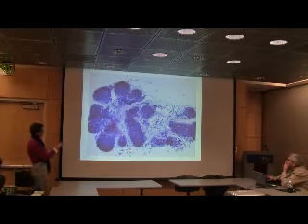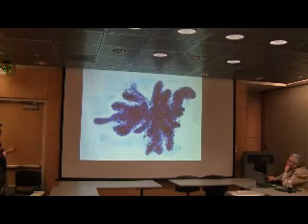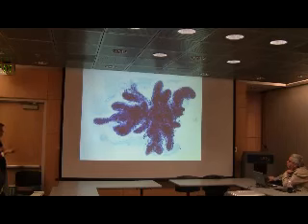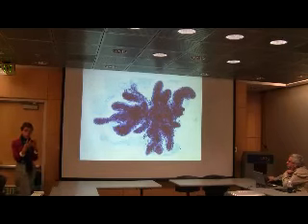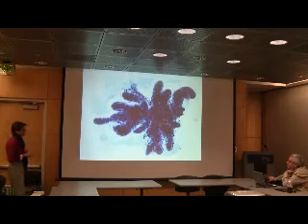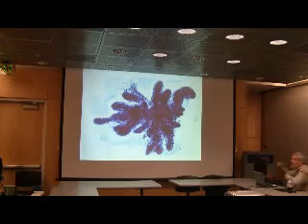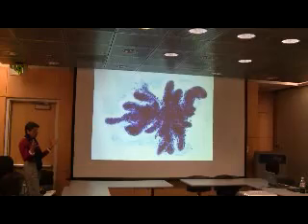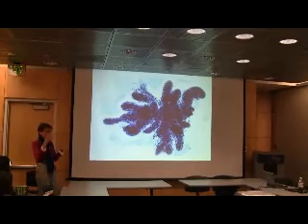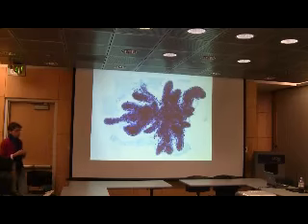So this particular example has fairly rounded lobular structures. If you look at the next one, they're more finger-like. And this is just an example of the variability that you can see in a normal setting. Some are a little rounder, some are a little bit more finger-like. That variability might occur with different ages, with different parts of the menstrual cycle, with different genetic background. We haven't done a controlled study of this, but I just know that when you look at these kinds of samples, you see a spectrum from one to the other. We know these are benign and normal, and it doesn't indicate a problem.